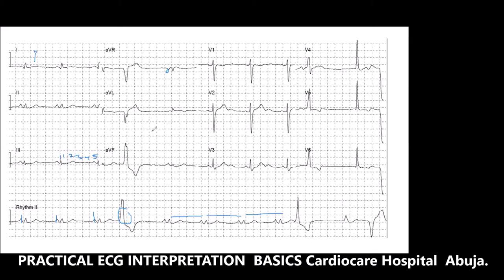Look at the normal QRS when you are doing those. Don't use the abnormal shaped one. Exactly. Forget that PVC, that abnormal shaped one. Forget that one. Okay. So, in lead one, is it positive or negative?